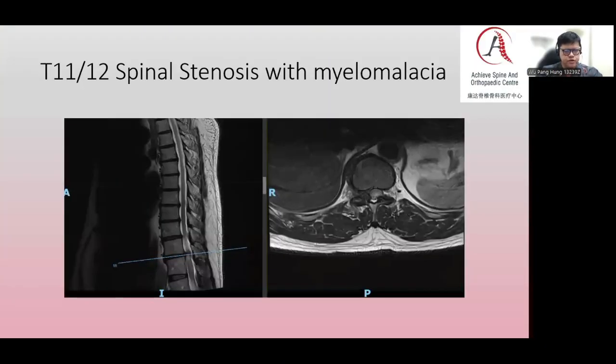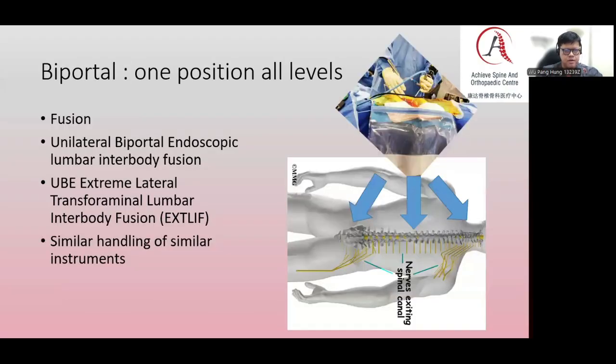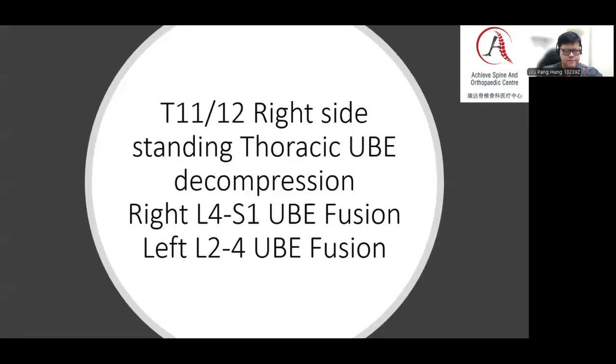And then we have an issue of the thoracic myelopathy, and we did MRI. The rest of the thoracic spine is clear, but at T11-12, there is severe spinal stenosis with myelomalacia. So this is an opportunity where we can clear all this stenosis at one shot because of the versatility of biportal endoscopy. And we can, through our experience, also insert even very much larger cages. For these purposes, because of coronal tilt, we wanted to correct it with T-LIF cages.